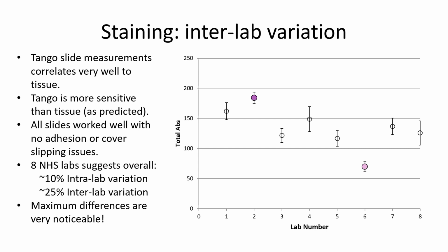The colour in the centre of the patch is the mean intensity on the slides. And we can see there is about a 10% variation intra-lab, about 25% variation inter-lab. So relatively good within a laboratory, but between laboratories there can be quite a lot of variation. And as said before, now we can quantify this. We can start to apply targets, thresholds, and then standards. That will drive up the consistency, at least, of production of slides across all laboratories.